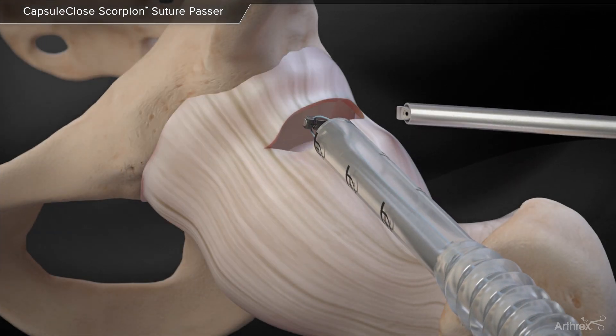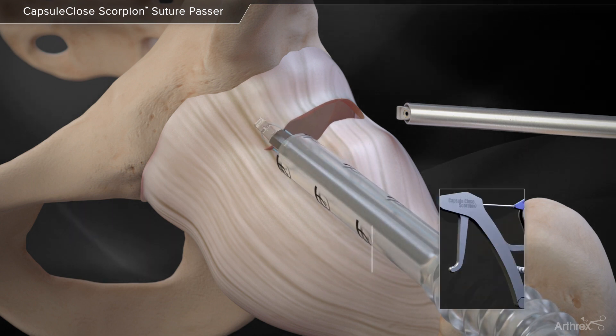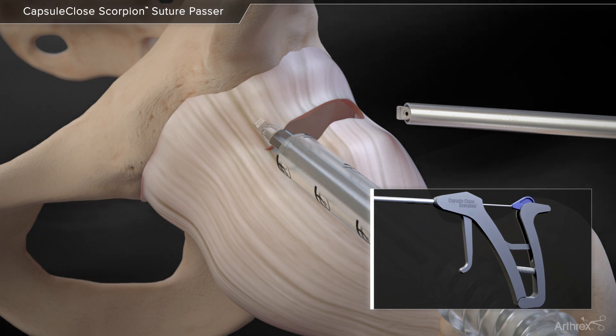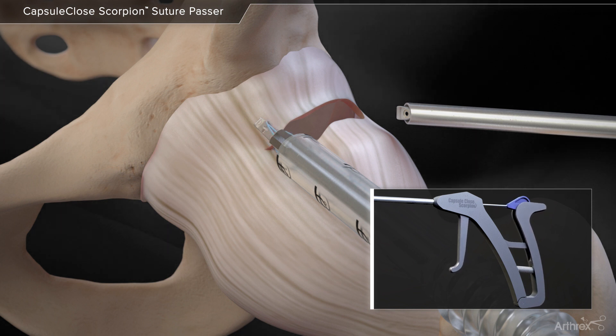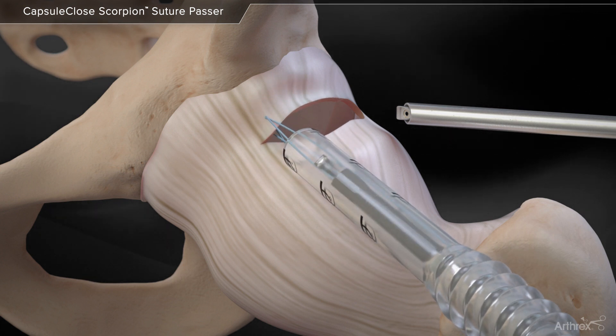Introduce the capsule-closed scorpion through an 8.25 mm Trimit cannula. Grasp the capsule by squeezing the front trigger of the scorpion. Advance the needle by squeezing the rear handle until a click is felt. Rotate the scorpion to disengage the bottom jaw from the tissue and remove.